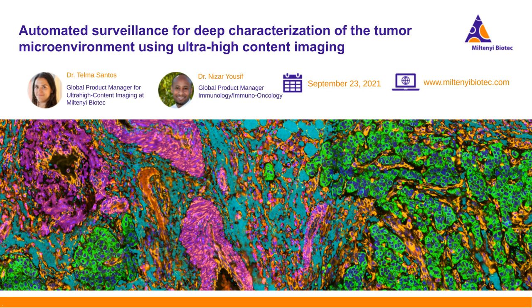What type of data output does the imaging analysis software generate? That's a great question. So QI-tissue will analyze your images and will have a quantification after segmentation based on your cells, or if you want to do image segmentation based on pixel sizes, you can also.